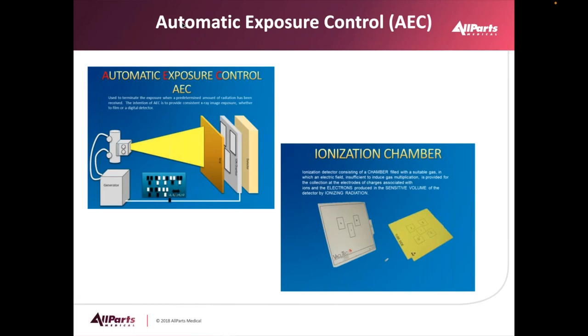We need a way of turning the X-ray beam on and off fairly quickly. So there's a circuit within the X-ray machine called the AEC, or automatic exposure control. This is comprised of a control circuit and an ion chamber. The ion chamber reads how much X-ray has hit it, and at a certain point that we set up on our control, it turns the X-ray off.